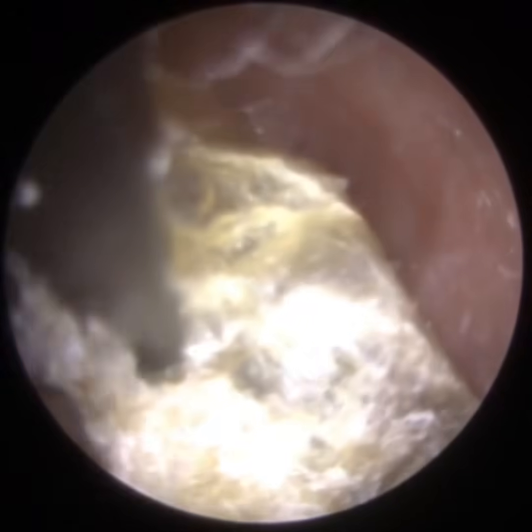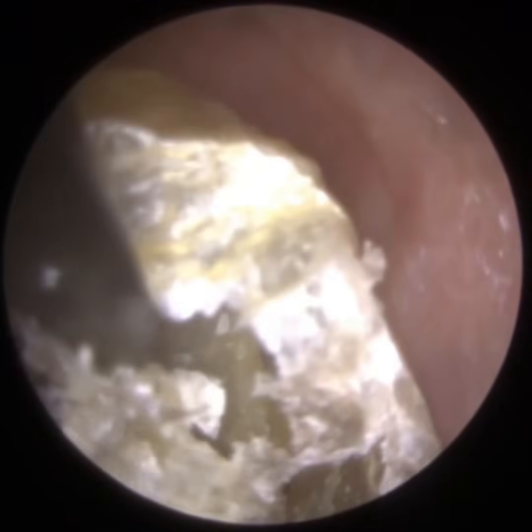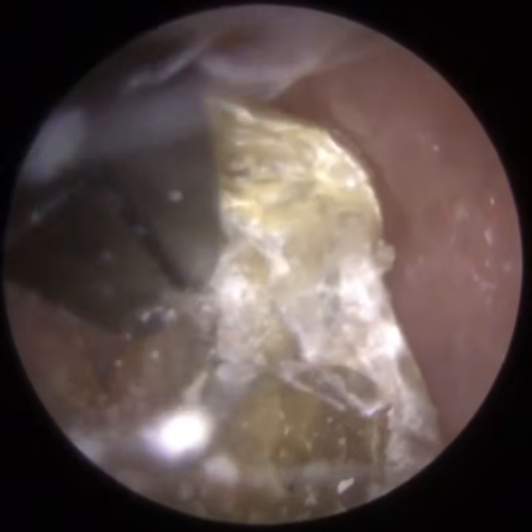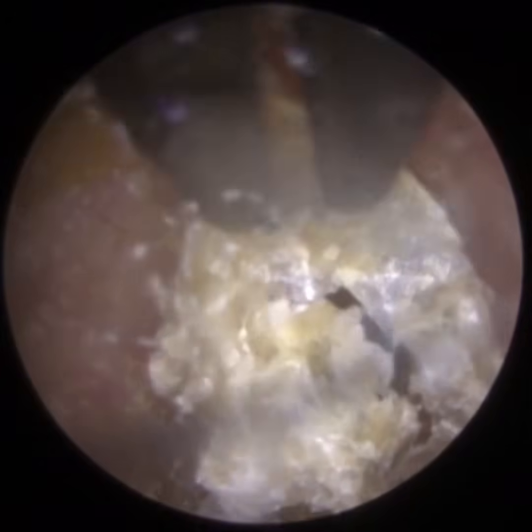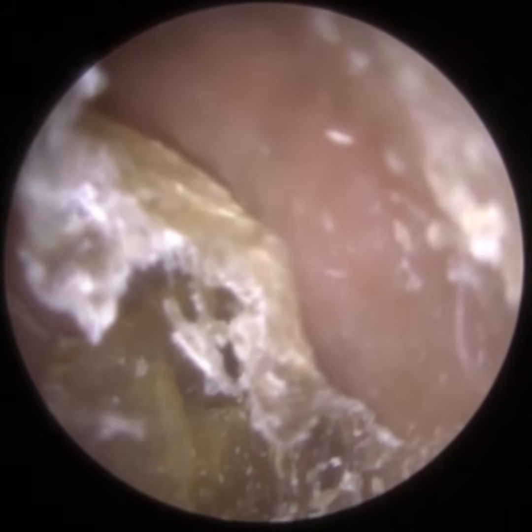Even though it's still a bit tricky to get the correct grip, because this dead skin was oriented in such a way, it's hard to get over the skin on both sides. Each side of the jaws of the forceps is either side of the dead skin layer. The bottom jaw is close to the posterior canal wall there. So just raise it upwards, trying to go down. There's a bit of skin that's facing towards me there. Unfortunately, that time, the skin just shredded. It didn't come out in a big cast.